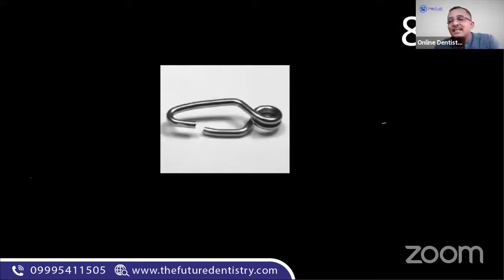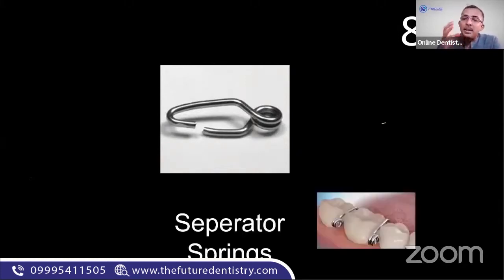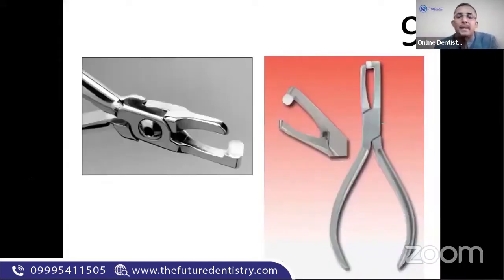Any idea? This is there in textbook biology also. Come on. It's a very common, it's a very old tool. Nobody uses these days. This is a separator spring. This is also used if you do not have an elastic or the elastic is not going in. You can use this spring and put between the teeth from top and bottom. Teeth will separate. Whether it's elastic or spring, it will separate.